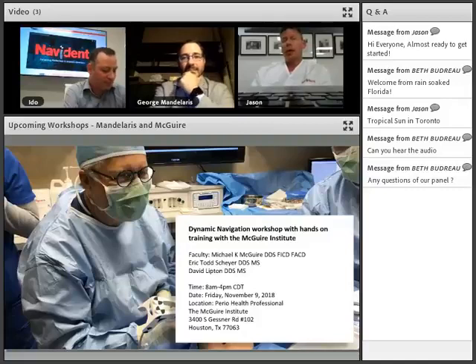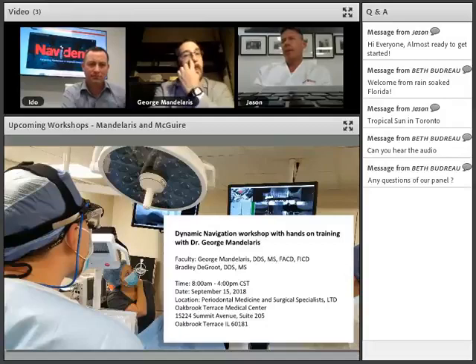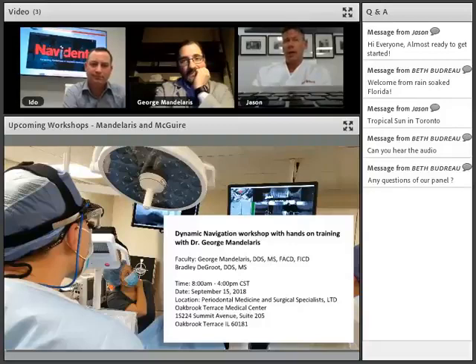And then with the fiducial, consistently it was 0.52, 0.53. So we drastically increased, and that's with doing 3 points on the tracers. If you do 4, it goes up by, I believe, 0.3 or 0.4. So not super significant, especially if you're only placing 1 implant.